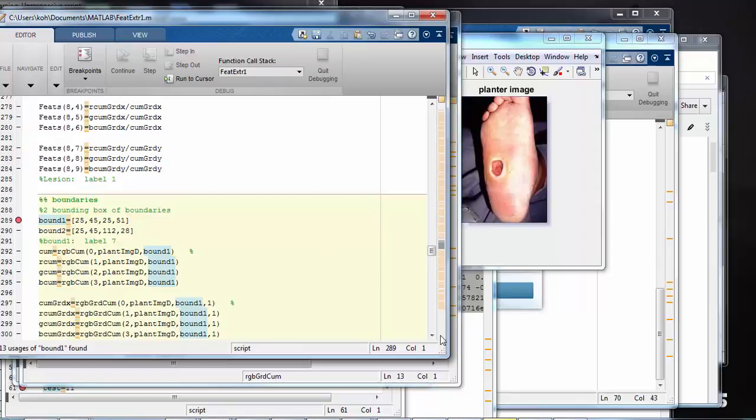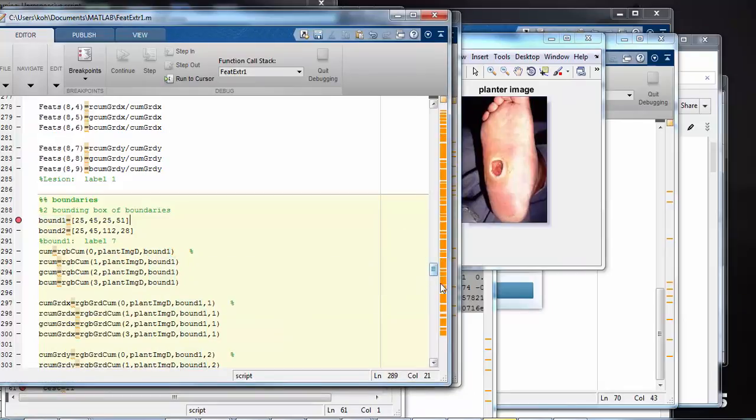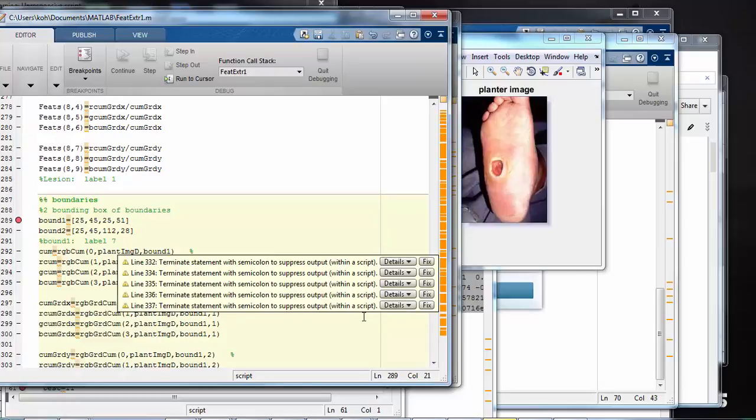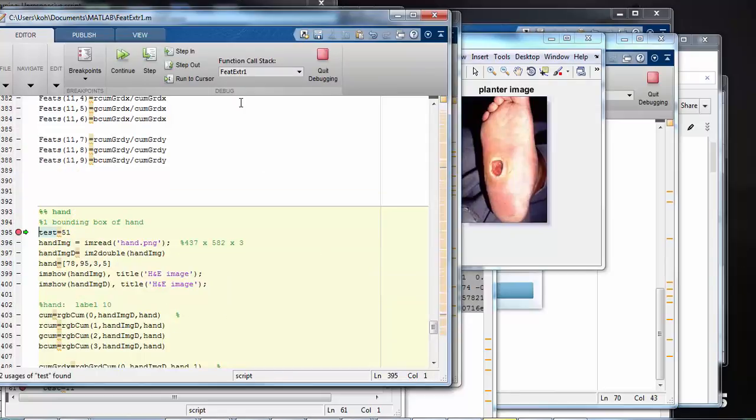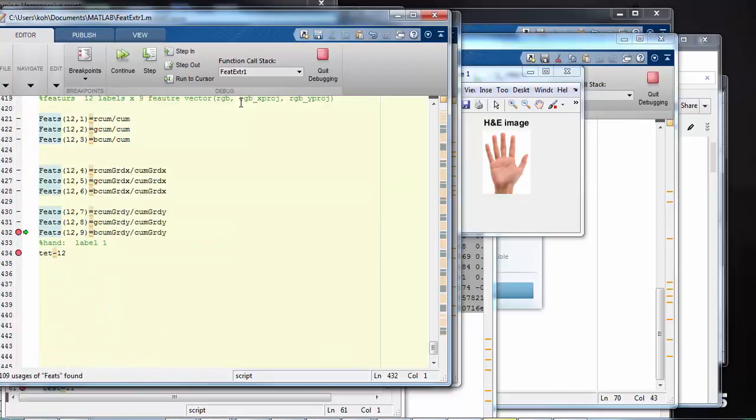The feature extraction takes a little bit of time, in total around, well, and then it computes for the non-foot image. For example, here we put the hand. So we obtained the 12 different sample areas of a 9-dimensional one, and then we computed the covariance matrix and then obtained the large eigenvalue.